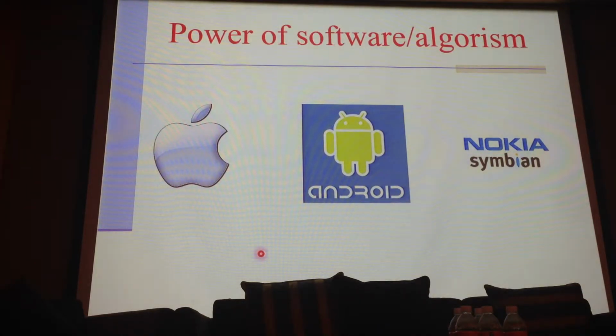That's the power of the software or algorithm. Just the same in the OCT market. Right now we have very similar hardware configuration: the spectrometer, line camera, mainboard, high-speed computer, but the software is totally different. The algorithm is different. SADA is algorithm. Actually, Optovue dedicates in OCT only, so we have a lot of software. For example, ganglion cell complex (GCC), or ETM (epithelial thickness map), or cornea power (TCP), and SADA, MCT. All of these are software, right? And that's the power of the software.